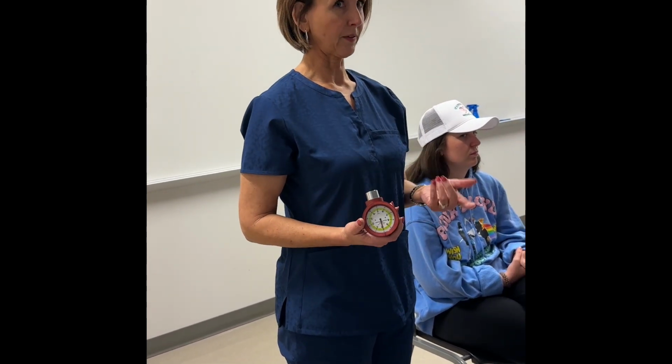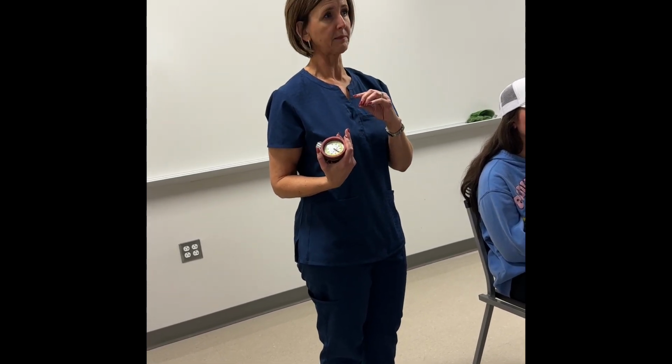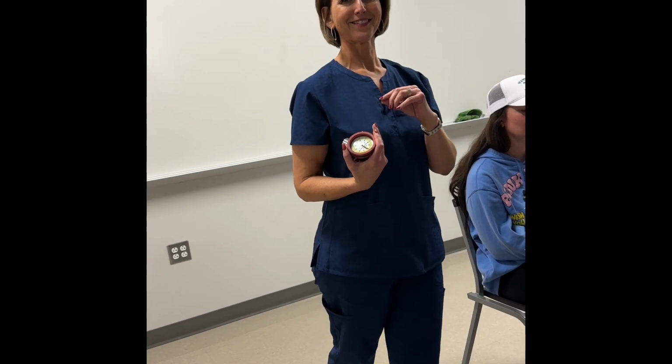I got 1.124. That's exactly right. 1.124 what? Oh, liters. Okay, so here's the deal. When you're thinking about breathing, you don't know what normal is, and we breathe heavier. Plus that filter she has to breathe through causes a little bit of resistance, so she's working just a little bit harder, which is why that tidal volume's bigger. Does that make sense? You can go ahead and turn it off now.